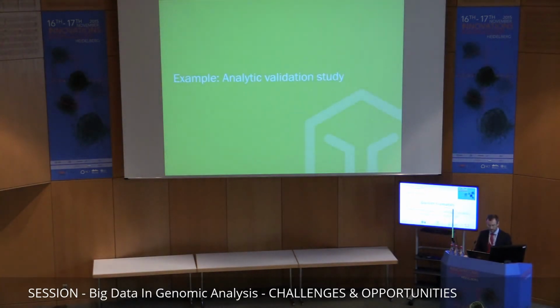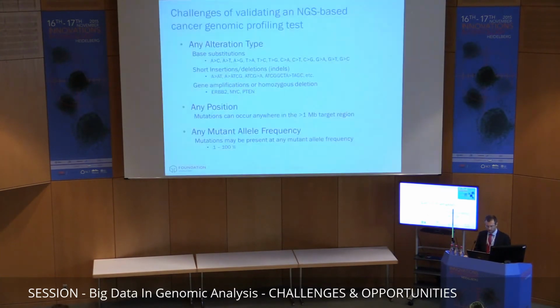So I'm going to give you a little example of analytic validation. I'm actually not going to talk about the specifics of the data much from our company that's been published, but I just want to talk to you a little bit about how we approach this problem.